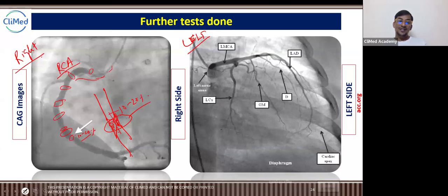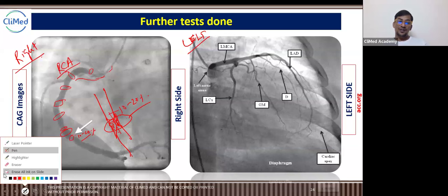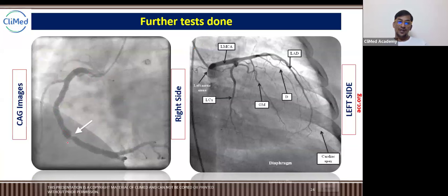So this is the blockage of the heart, guys. Here is the blockage in the coronary artery. Catheter sizes are different, based on the different patients. We will talk about that in the next class, definitely in the CAG class, but not today.